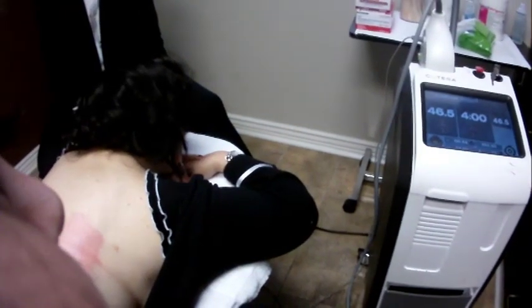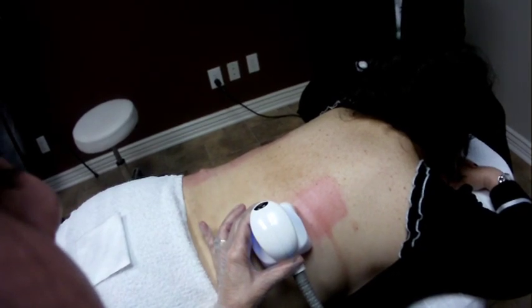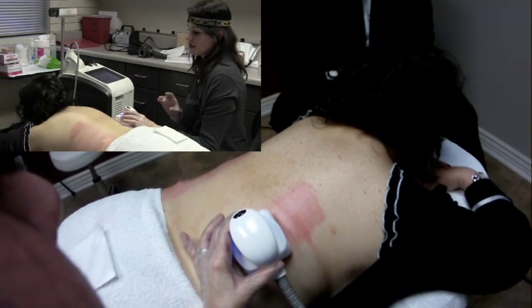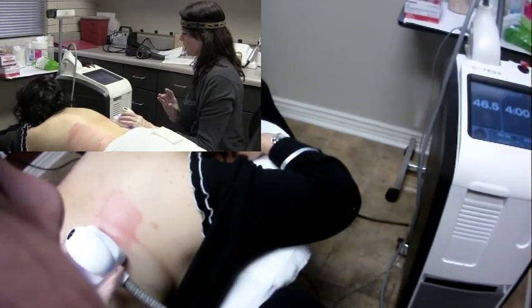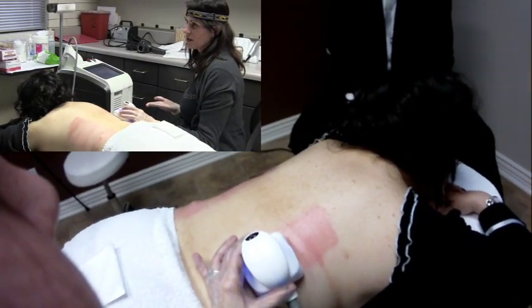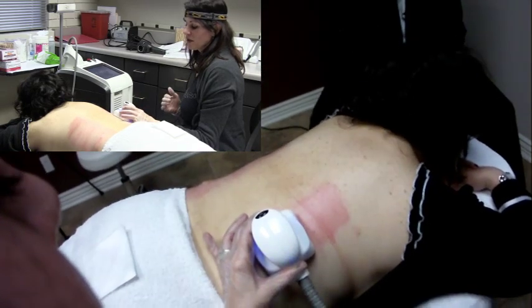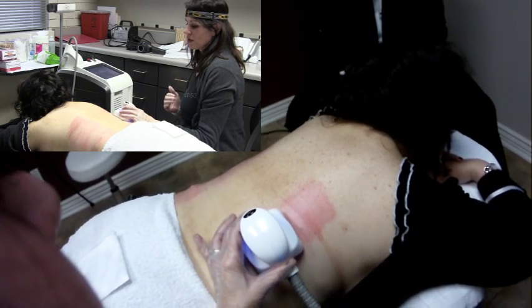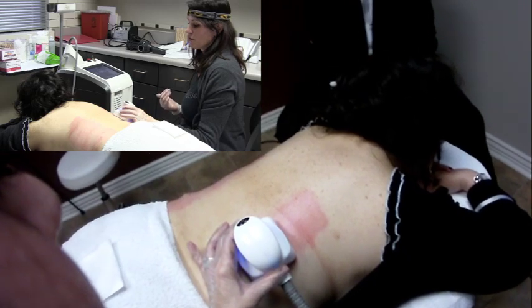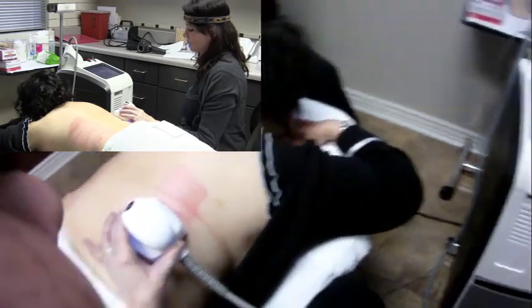You'll notice I keep looking over at the machine because I am doing four-minute increments. What we are trying to do is get the heat in the tissue up to between 46.5 to 47 degrees centigrade, which is close to 120 degrees Fahrenheit — it's pretty warm. The reason we can do this without burning the skin is the length of time we have it on the skin — we're only doing four-minute increments. If we were to leave this on one area for about two hours, we'd probably leave some blisters.